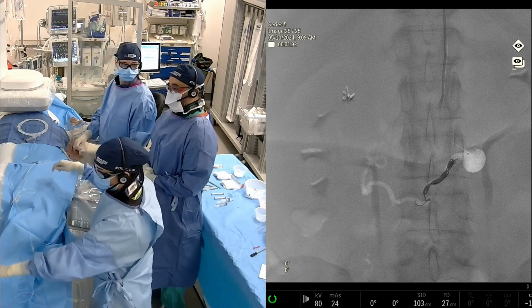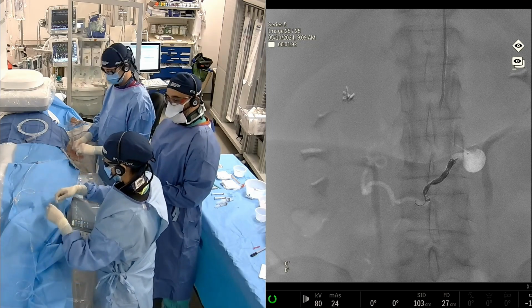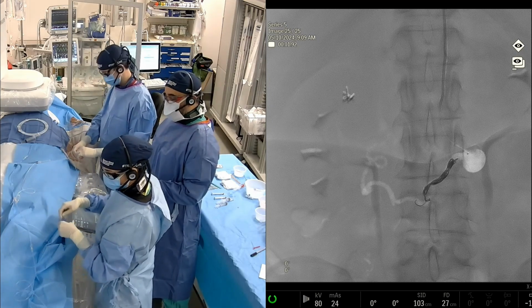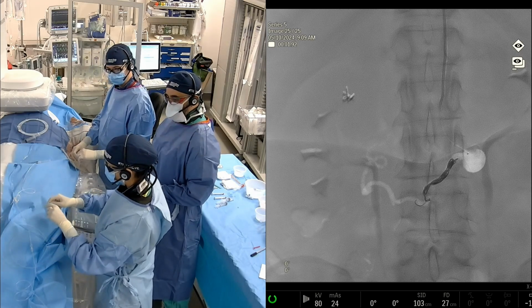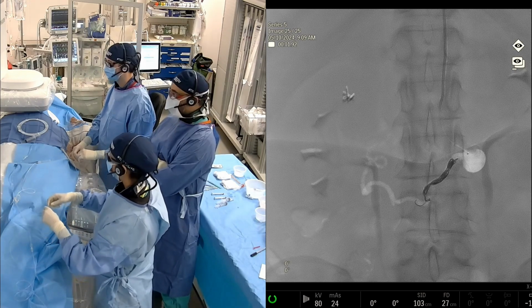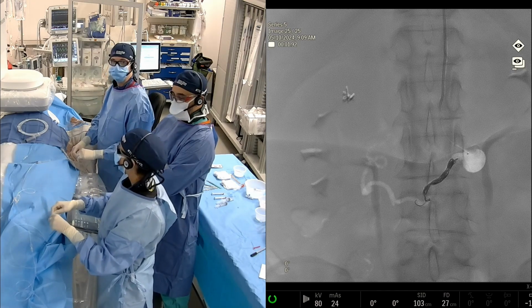And it's fully retractable, or is it? Yeah, it's fully retractable. Once we get this one in, we'll show you how it detaches. It's actually a nitinol push wire, which is nice. So this is like literally you can't kink it. Can we zoom in? You can't kink it. Yeah, let's zoom in. On the hand. They want to zoom in. We're gonna watch you guys deploy it because we want to see the mechanism.